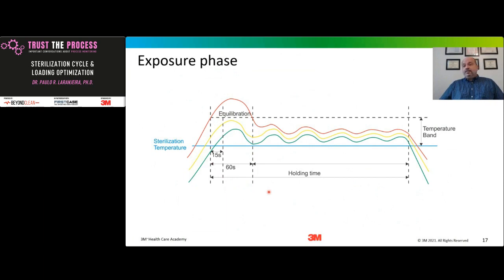And that's related to temperature, and temperature calculated by the pressure, the measured pressure. So they have to be inside of a temperature band of 3 kelvins during the holding time. So during the whole exposure phase, they would have to be within this sterilization band. And they can differ by one another at 1 Kelvin. And I have to make sure that they hold for that period of time that has been programmed on the sterilizer.